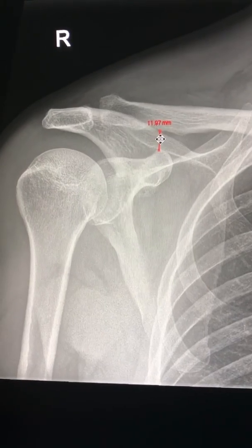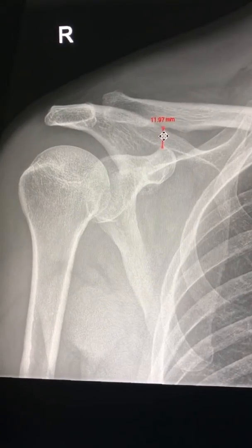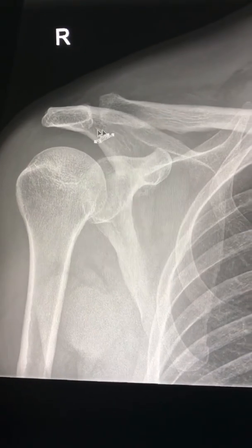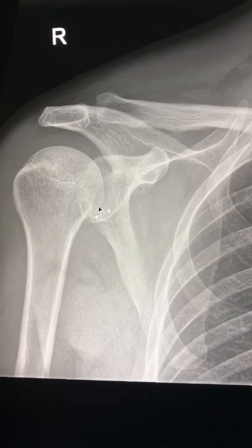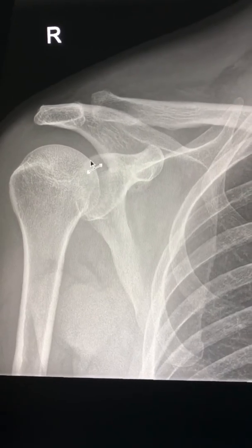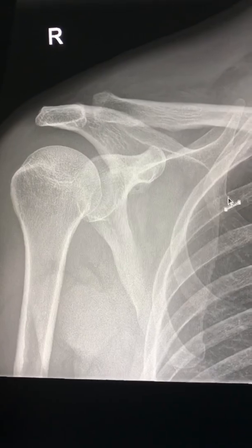Then we have to check the coracoclavicular distance, which is 11 millimeters in this case and should be less than 13 millimeters — anything more than 13 millimeters is suspicious of coracoclavicular ligament disruption. After that, we have to see the proximal humerus and humeral head, then look carefully at the glenoid and the scapula. Don't forget to see the scapula, as it is very easily missed.